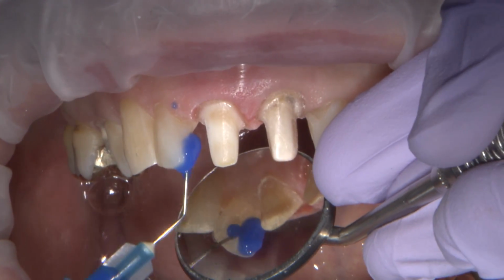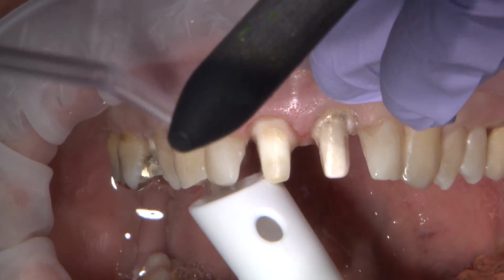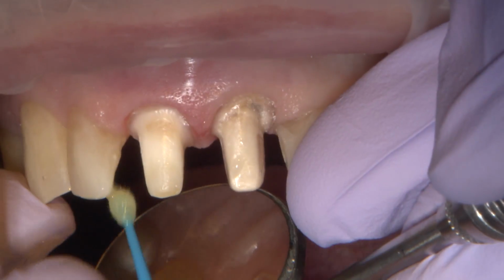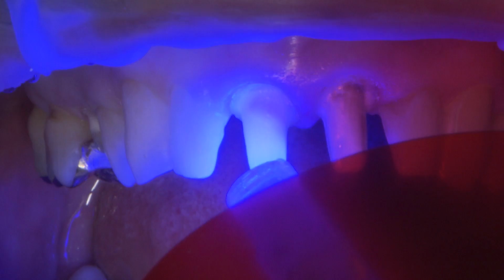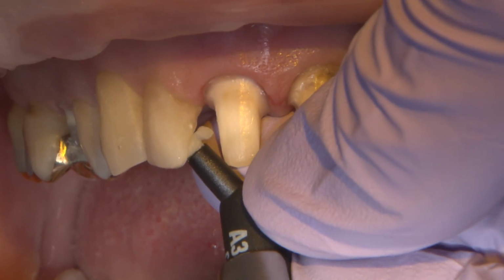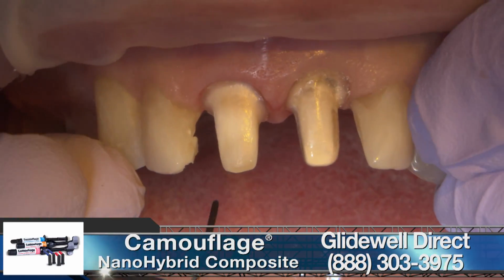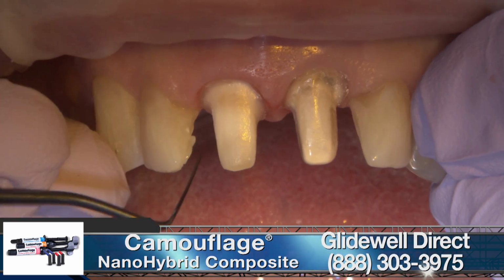So following a standard bonding protocol with phosphoric acid, etch at 37% to condition the enamel surface, apply the bonding agent, and then light cure that bonding agent and carefully apply a very thin layer of the A3 Camouflage Universal composite just to adapt that to the tooth surface on number 7.